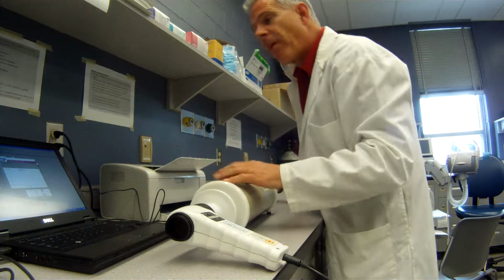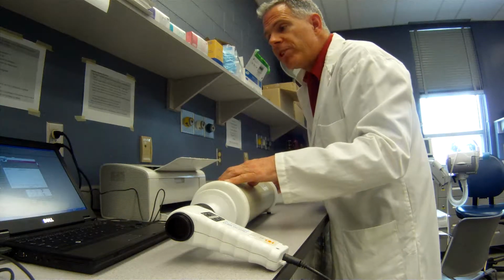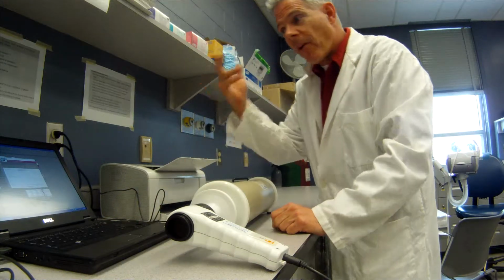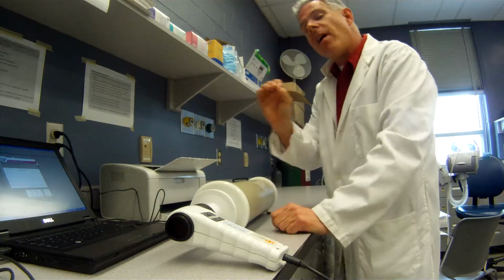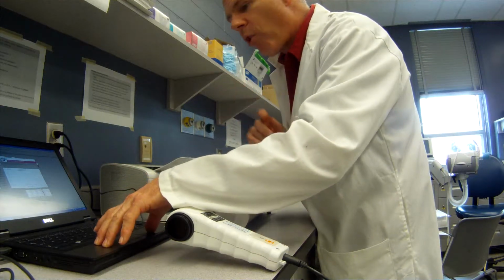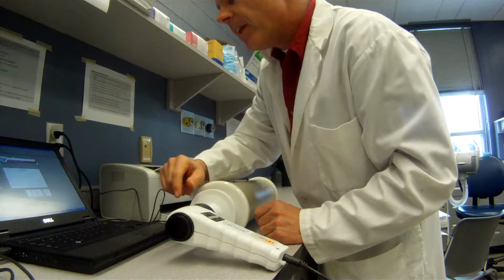So hit the space bar again. Now I'm going to reach that low flow line. Okay, success. All right, it measured that as 2.98. So it verifies that it's working. But we haven't done it at the higher flow rates yet. So I'm going to hit continue.